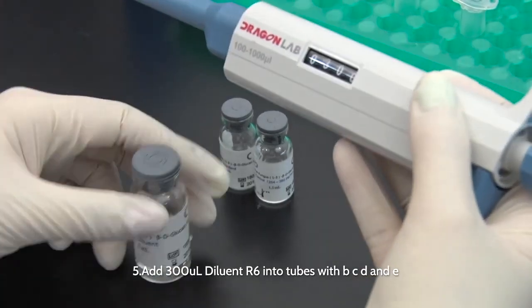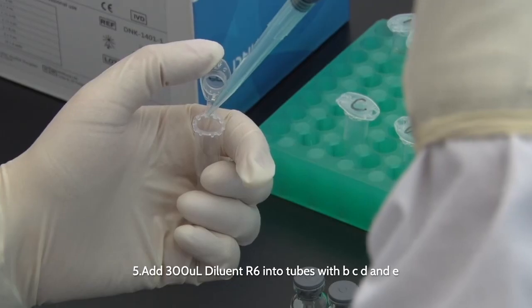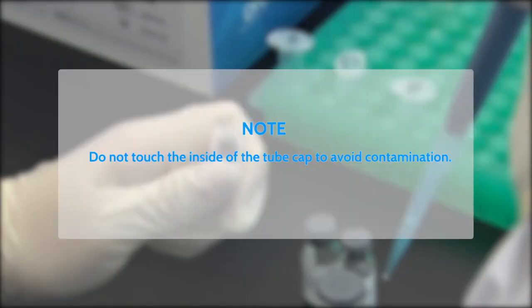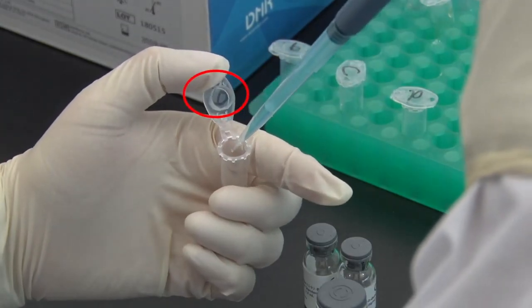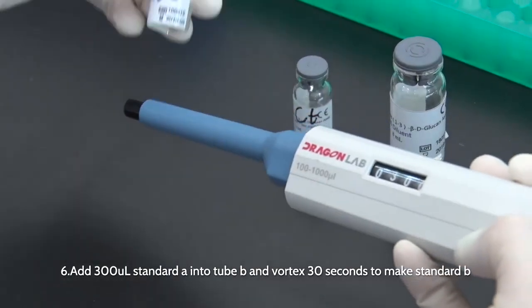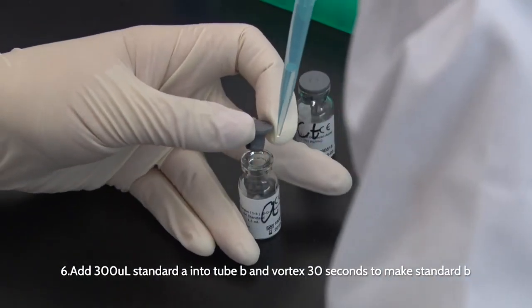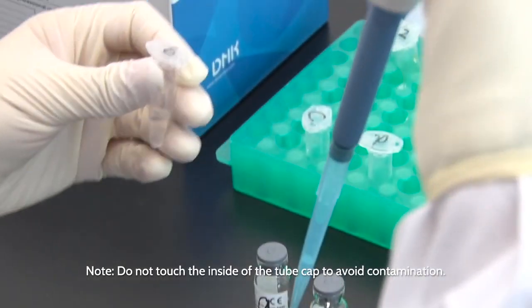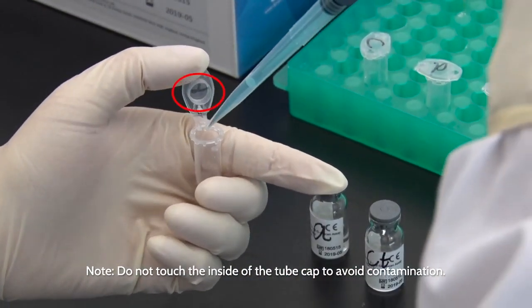5. Add 300 microliter dilute R6 into tubes B, C, D, and E, respectively. Note: do not touch the inside of the tube cap to avoid contamination. 6. Add 300 microliter standard A into tube B and vortex 30 seconds to make standard B. Note: do not touch the inside of the tube cap to avoid contamination.